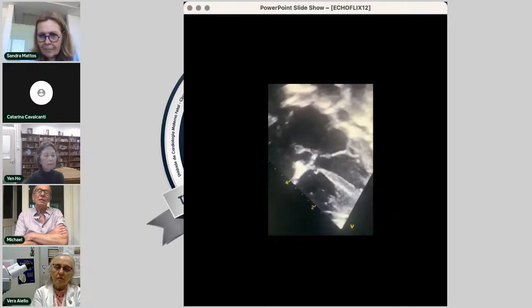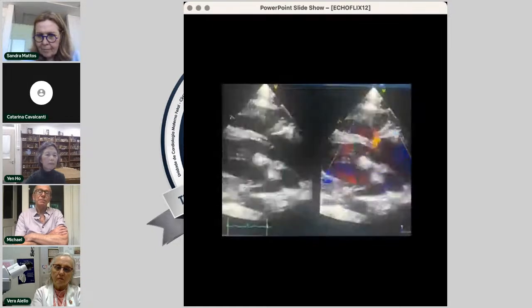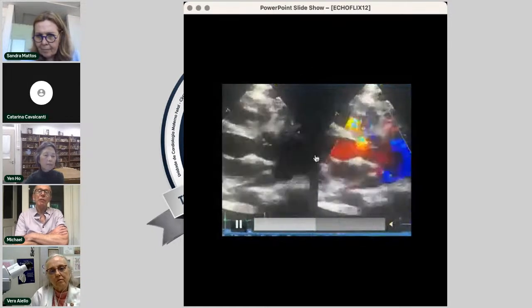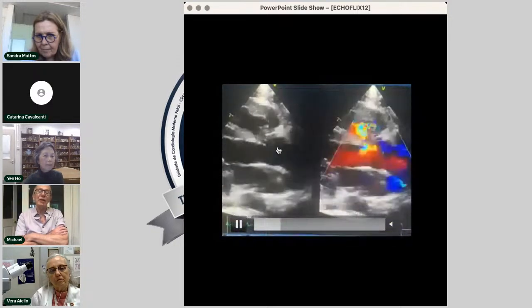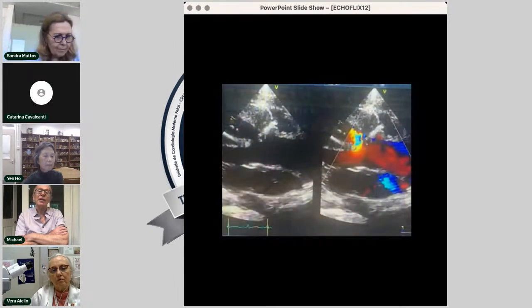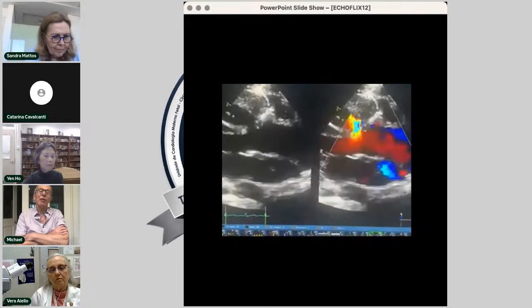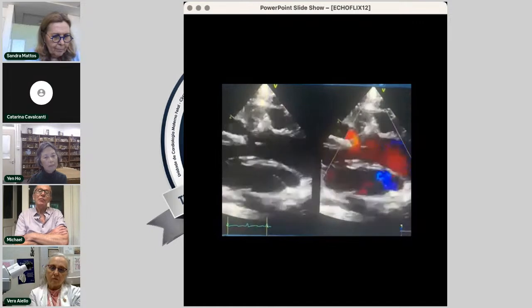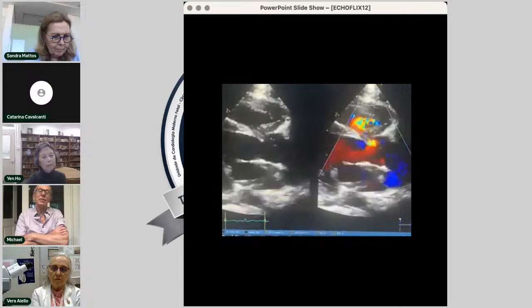And when we get to the parasternal or apical long axis view, you will also notice that the aorta arises virtually entirely from the left ventricle. So there's not any override, which of course sometimes occurs in tetralogy. There is no override, but you'll also see here the ventricular septal defect does look rather small. I probably didn't send the Doppler of the gradient, but it was 50 millimeters of mercury. So it'd be interesting to hear what the morphologist's take is on restrictive VSD in tetralogy, which is relatively rare, in fact, but we see cases occasionally.